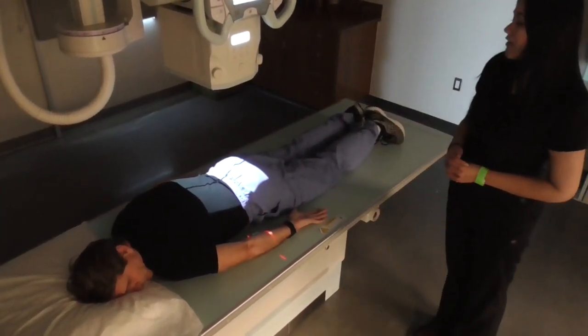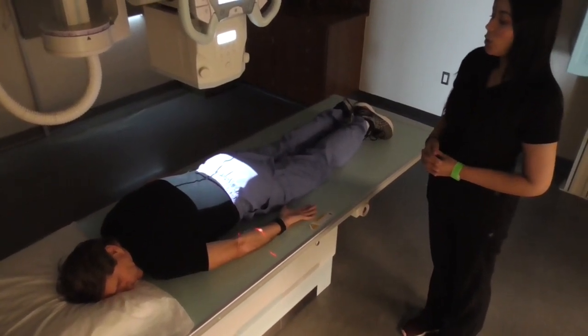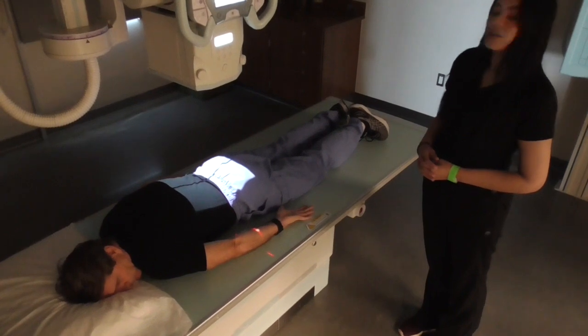There we go. I would have my patient take a breath in, blow it out, hold your breath out, and expose.